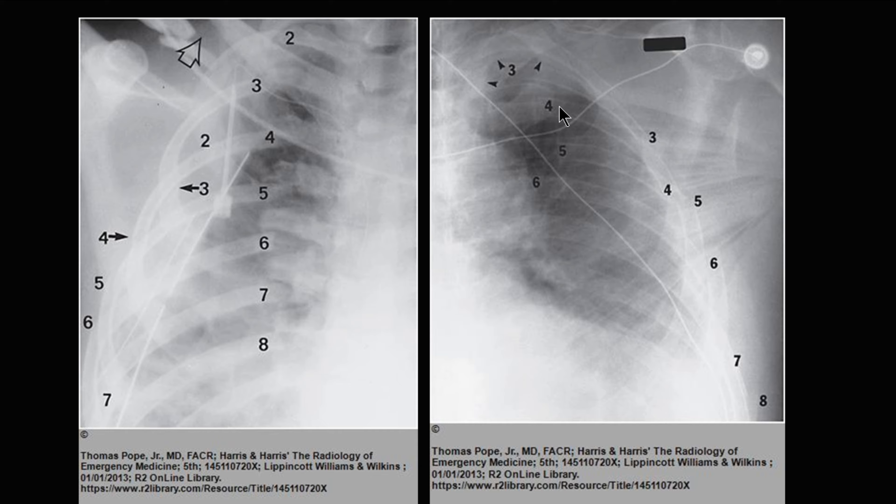You have more than three fractures, more than one fracture within the same rib, and this is in fact a flail chest. Additionally, there are fractures going down into the seventh and eighth rib. This person is going to have a lot of pain and should most likely be admitted to the ICU for pain control, Q1 vital signs, pulmonary toilet, and monitoring of their ability to breathe depending on their age.